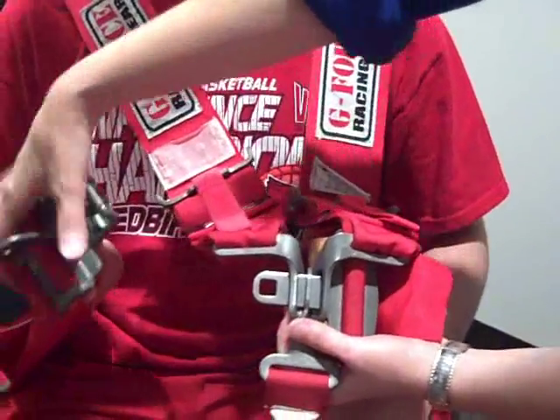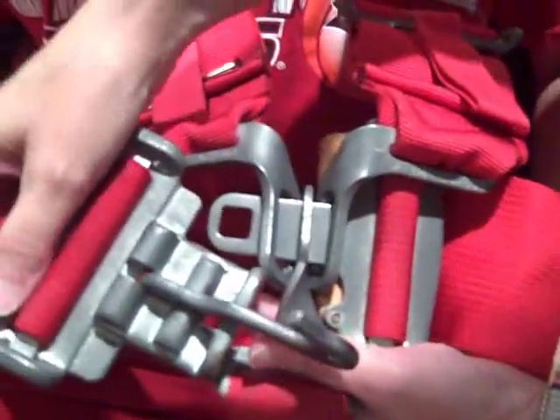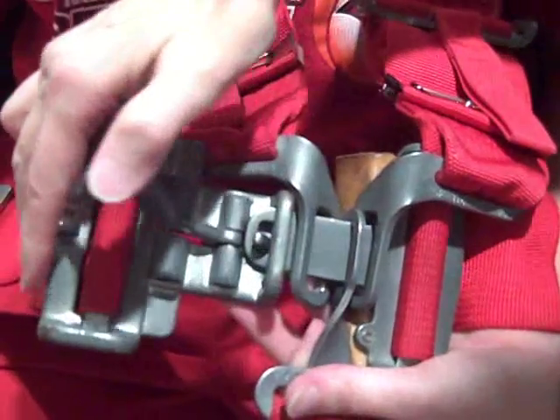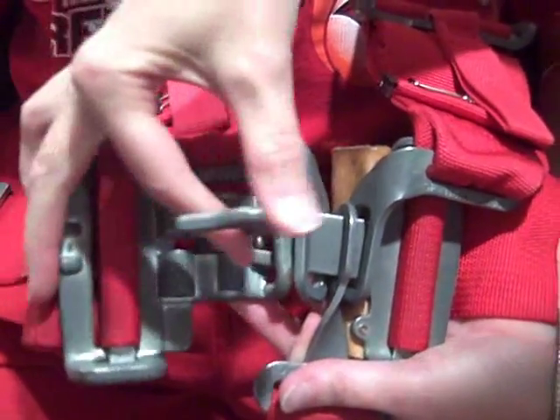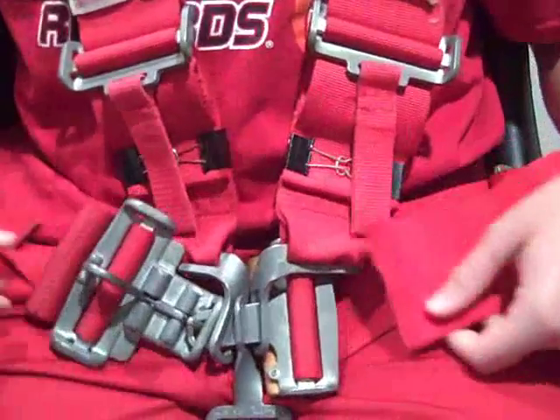Finally, the right side hip belt has a hook. You want to flip that hook back, latch it into the tongue, and flip it forward. Notice the tiny hook catching the tongue. Press down and fasten.